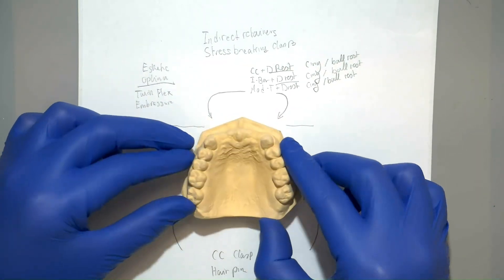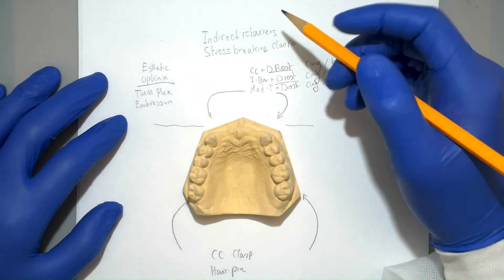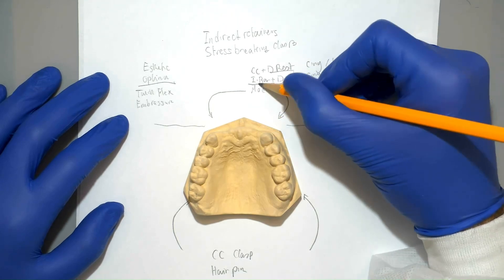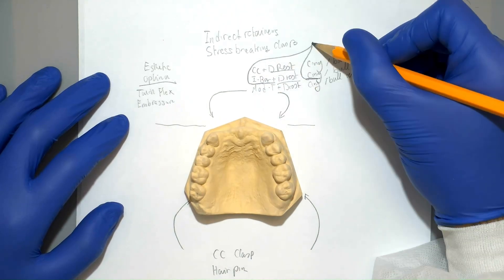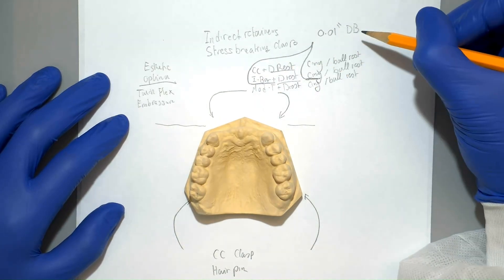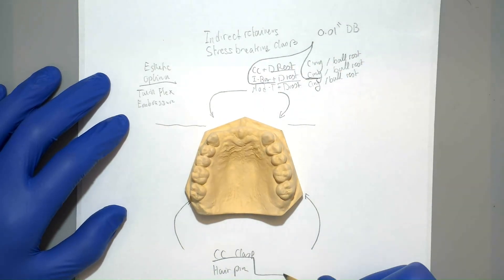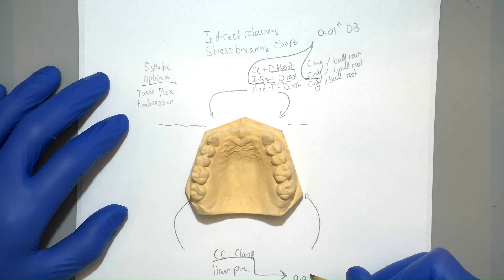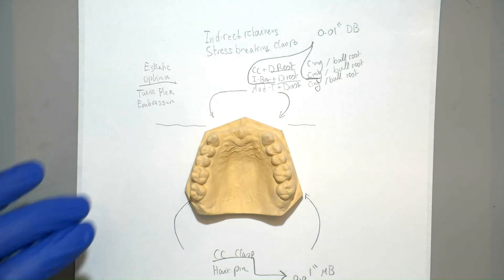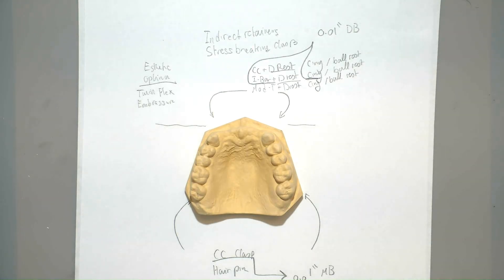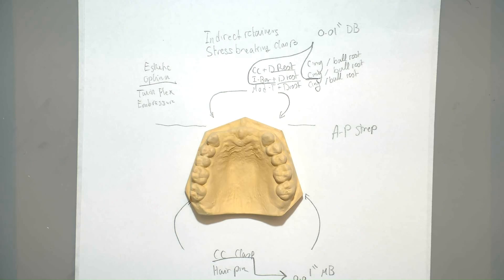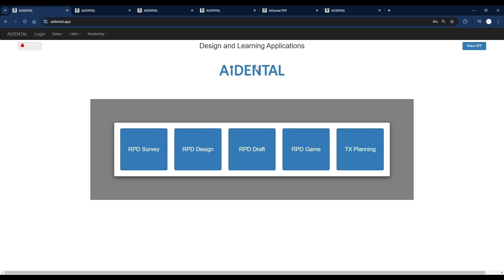But for now, let's focus on the traditional clasps, which would be an eye bar with a cingulum rest, which means we'll be looking for a 0.01 inch undercut on the distal buccal. And for the back, we'll be looking for a 0.01 inch undercut on the mesio buccal. And for the major connector, we'll use an AP strap or a horseshoe.